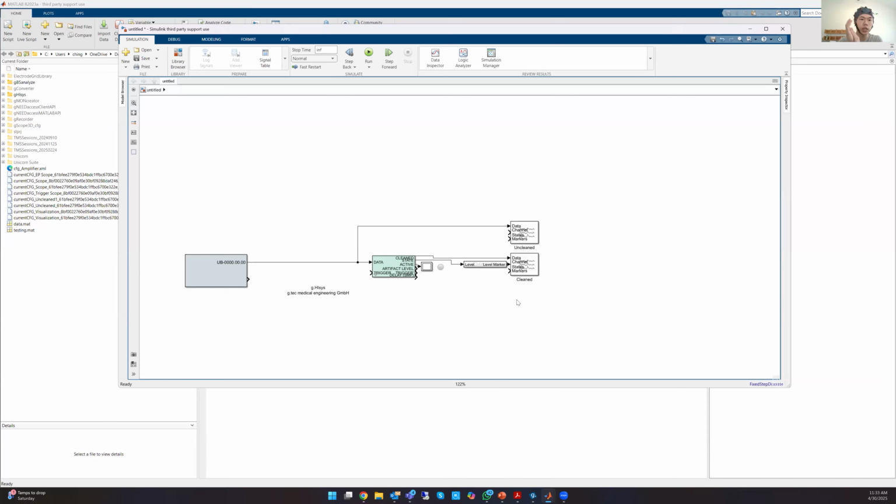Okay. Since I'm using dry electrodes, one important thing is that the pins are really touching the skin itself. So I need to twist each pin a bit, making sure the pins are perpendicular to the skin. The signal is really coming from my head.